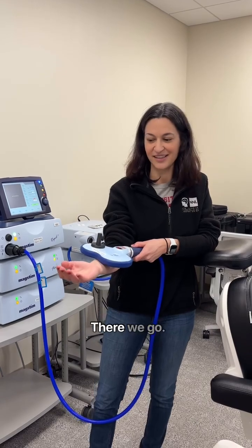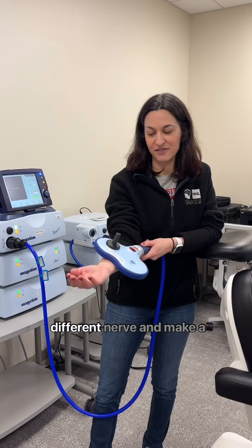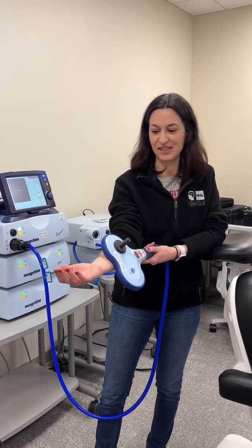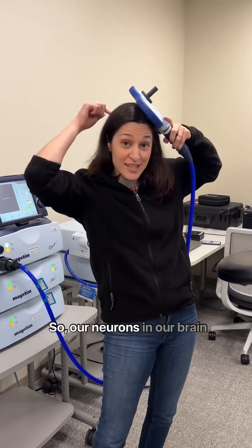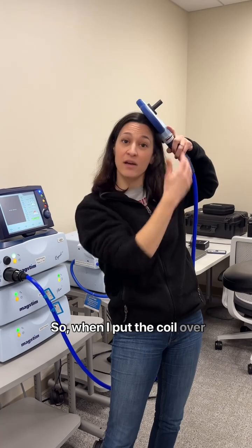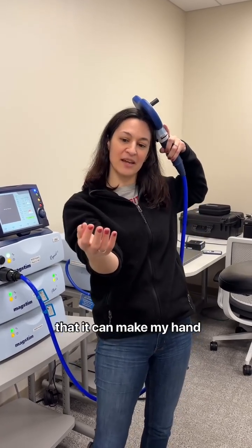If I move it over, it'll hit a different nerve and make a different part of my hand move. Our neurons in our brain also use electricity to talk to each other. So when I put the coil over the spot on the brain that talks to my hand, you'll see that it can make my hand move.